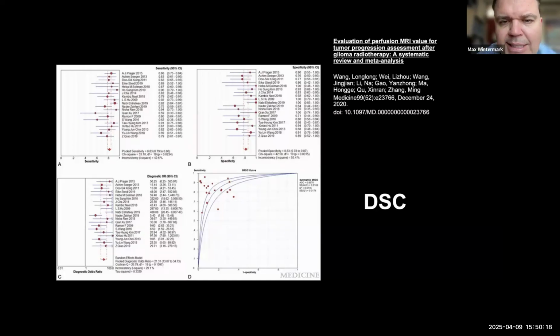The thing I wanted to insist on, though, is that none of those techniques is 100% perfect. None is 100% specific and 100% sensitive. That's why, when I told you it's typically elevated for this and decreased for that, there are of course exceptions. So you always have to take that information with a grain of salt.